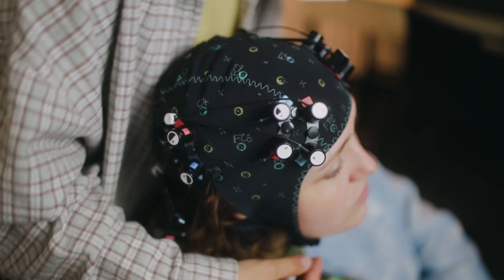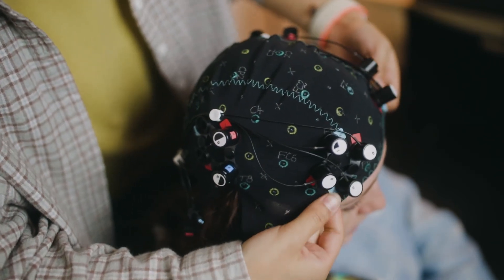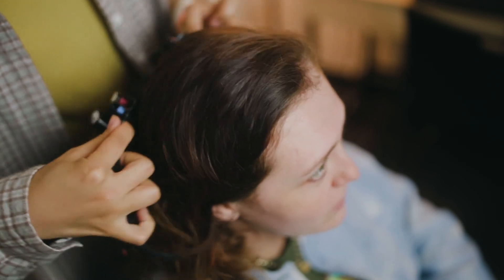Now let's pull off the cap. Hold the two sides, pull the front, and then just slowly take it off.